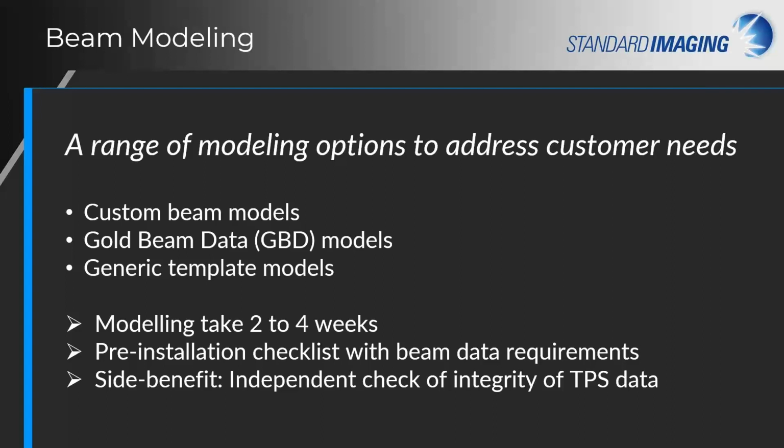So the backbone of IMSure 3D's precision and accuracy lies in the customer-specific beam models. The beam modeling is done by Marcus and his team at Scientific RT, who are by far the experts with over 20 years of experience with Monte Carlo and radiation therapy. This gives our customers confidence in knowing that their beam model is as precise and accurate, in some cases even more accurate than their treatment planning system. It is truly a meaningful second check, even for the most complex treatment plans.